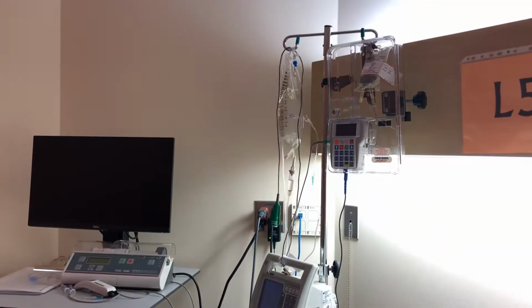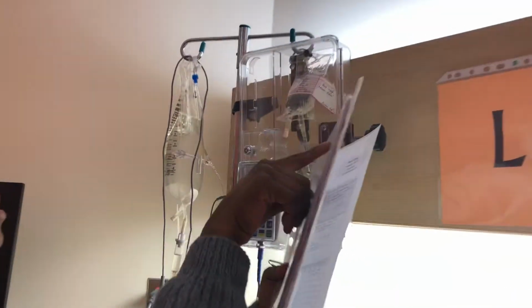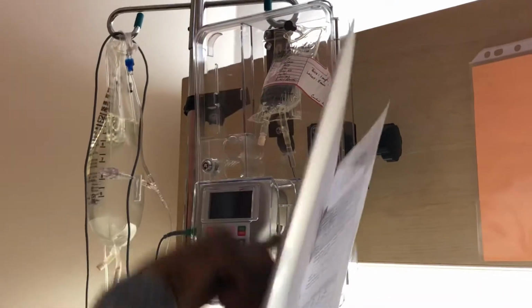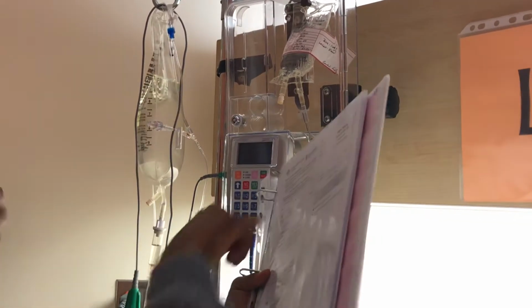So next, I am going to do my first check with what I have here. So right patient, Paris Mercy. Paris Mercy, can you state your name for me? Paris Mercy. Right drug is morphine. We have an order for morphine. Right dose is 1 milligram. Right route, this is going IV.